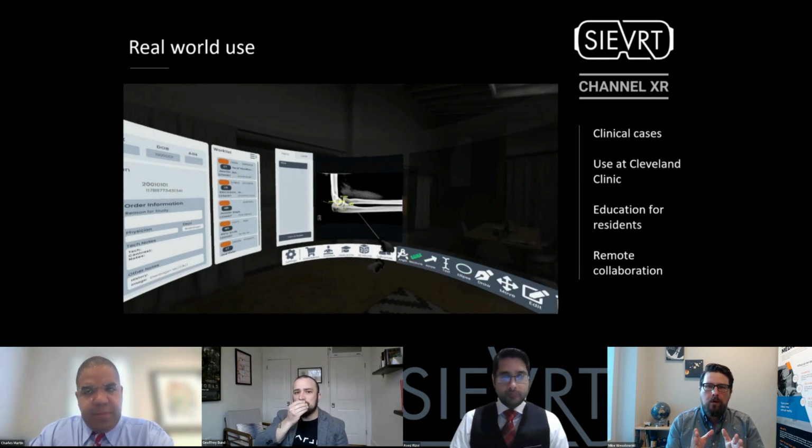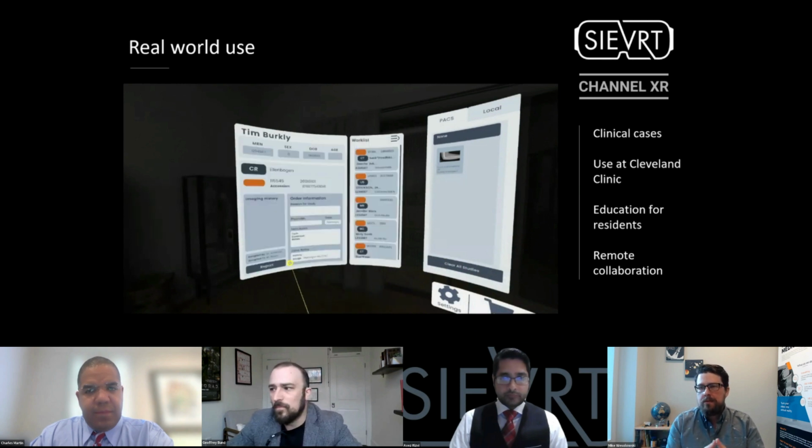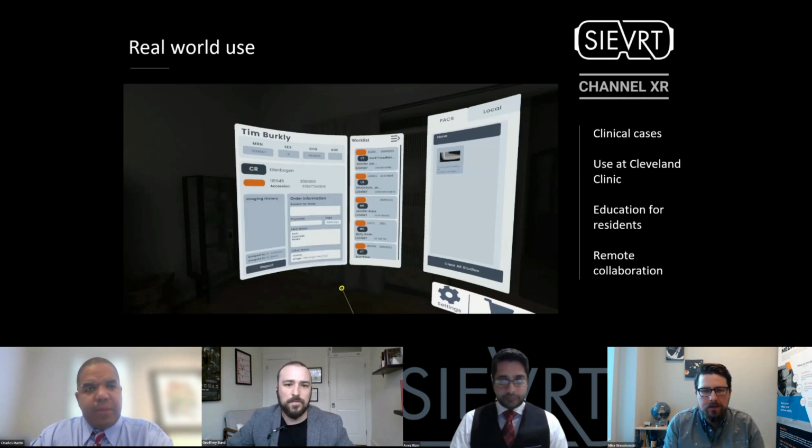We can work on PCVR systems like the Varjo, but we also have all-in-one systems, albeit they're able to do less. So, for example, on the Varjo, especially when we're looking at 3D images, or if we want to do things like pre-surgical planning with volumetric data, we really need that extra from the PCVR system. And obviously the clarity and the resolution of the Varjo put it ahead of many other headsets that are on the market right now. So that's the basic tech stack: we're built on Unity plus a whole bunch of other stuff that we need to do to integrate with medical imaging informatics systems.